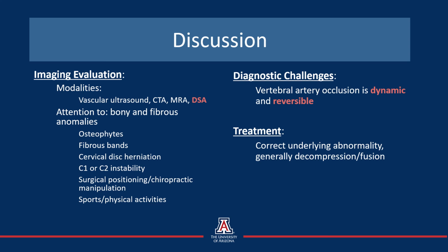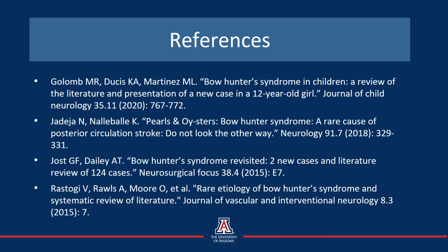On CTA and MRA, radiologists should pay close attention in regions of bony and fibrous anomalies, particularly at the C1-C2 disc level. Treatment is directed to correct the underlying abnormality, but generally includes decompression and fusion. Due to the rarity of this syndrome, especially in pediatric patients, there is insufficient data to reach consensus on management for this devastating syndrome.